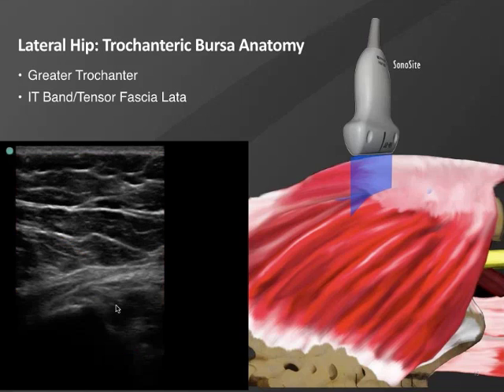We look now at the video, and you're going to see the hip being rotated. So the hip femoral head is rotating within the socket. This is the greater trochanter that is also moving, and you'll see the gluteus medius tendon attaching here will be moving as well.